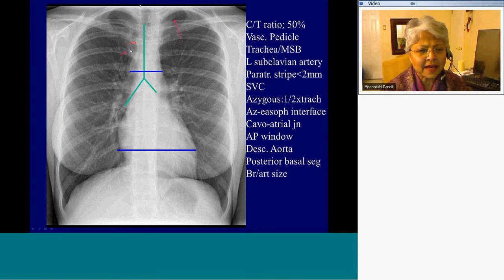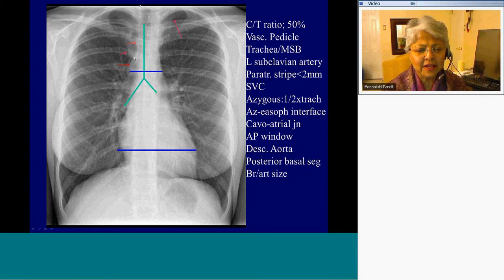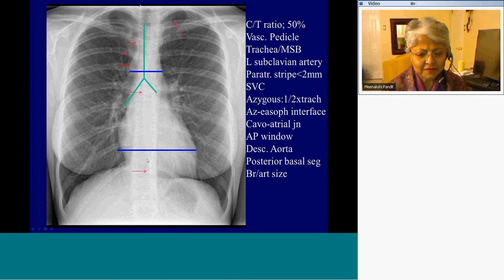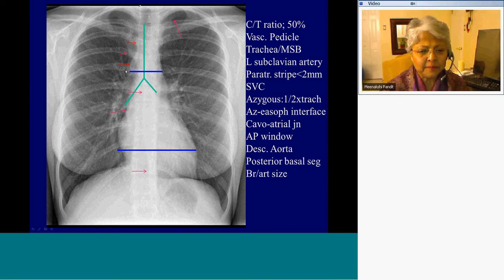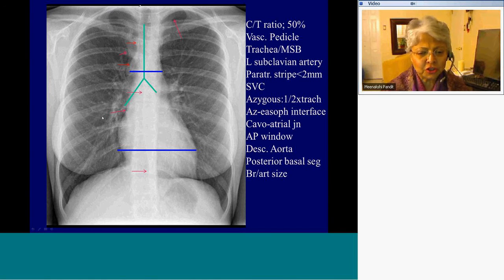This is the junction of the right innominate as it joins the left and continues on as the superior vena cava. This is the convex bulge of the azygous vein — it should not be more than half the tracheal diameter. This curved interface is caused by the contact of the right lower lobe with the azygous and/or the esophagus, and it's called the azygoesophageal interface. This point marks the cavoatrial junction, where the superior vena cava joins the right atrium and the convexity of the right atrium starts. This is an important junction to remember.